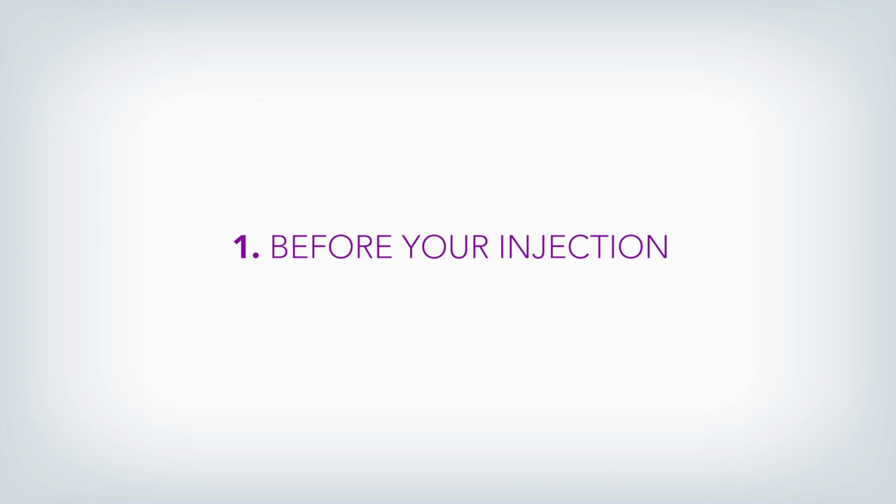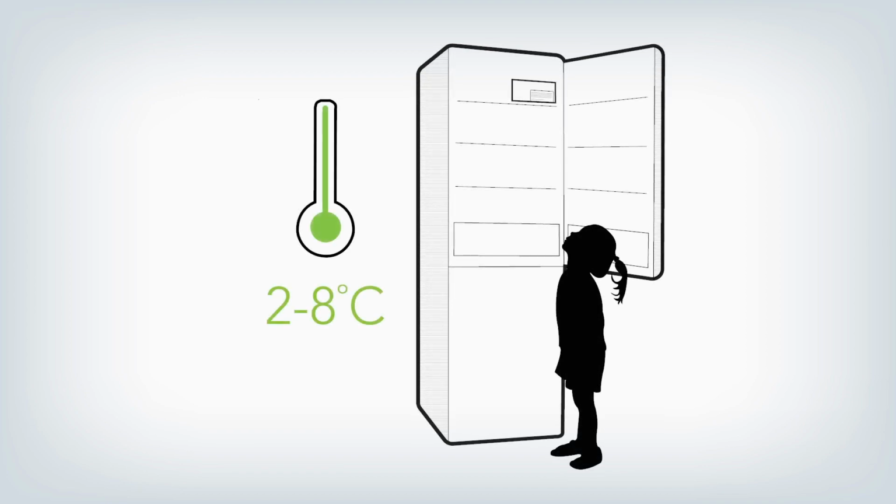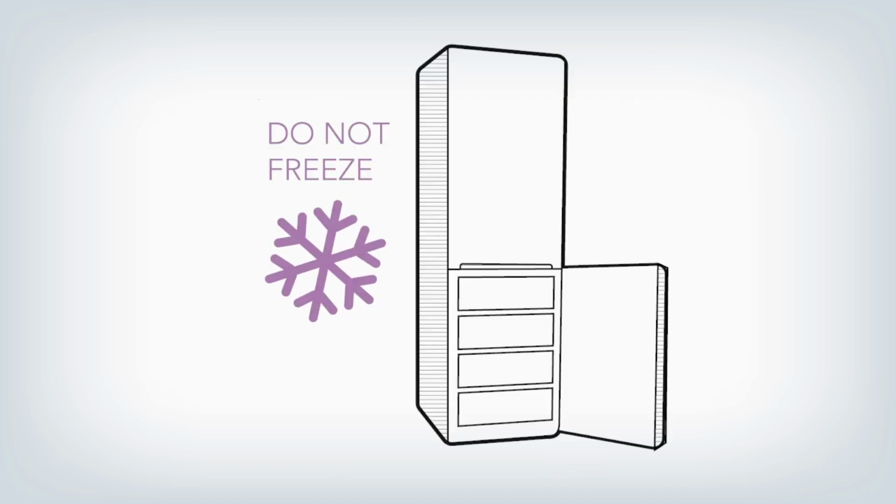Let's take a look at what you need to do before your injection. Keep unused syringes in the original carton in the refrigerator between 2 and 8 degrees centigrade, out of the reach and sight of children. Do not freeze.